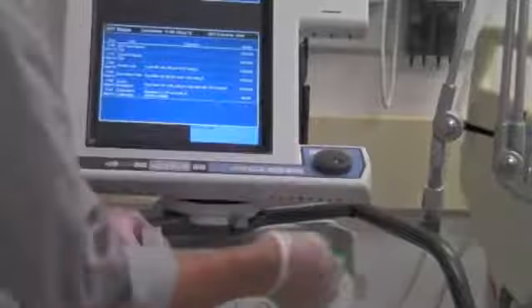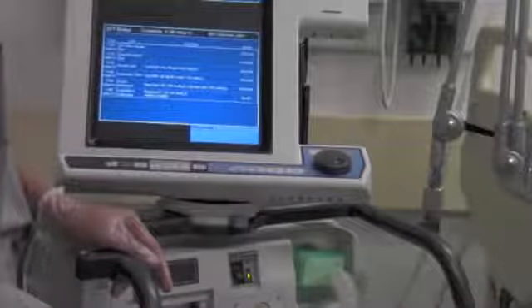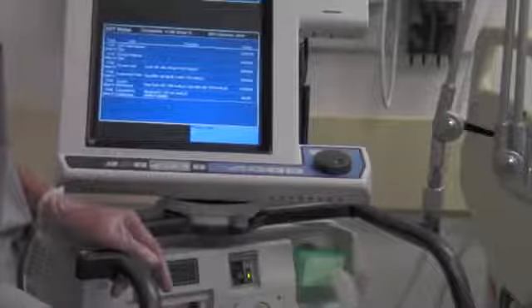The short self-test reports a test result status for each of the individual tests. Use Table 3-2 of the Operators and Technical Reference Manual to interpret the test results and to determine how to respond. This completes the Puritan Bennett short self-test tutorial.